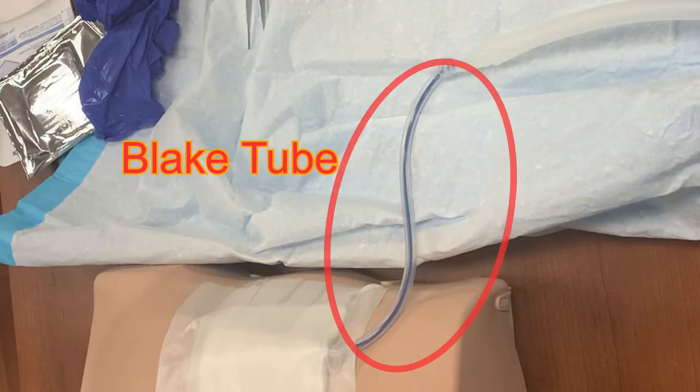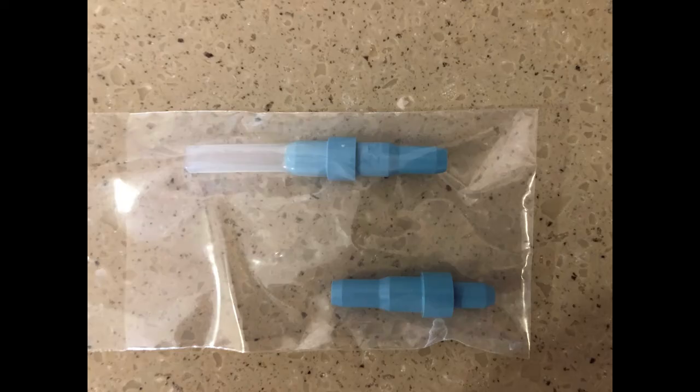If the patient has a Blake tube placed — the smaller gauge chest tube that is sometimes used — there should be a small adapter taped to the back of the Oasis system. Be sure to transfer that adapter to the new Oasis container. It will be needed near the end of treatment with this chest tube, and if it is lost, it is very difficult to obtain a new one.